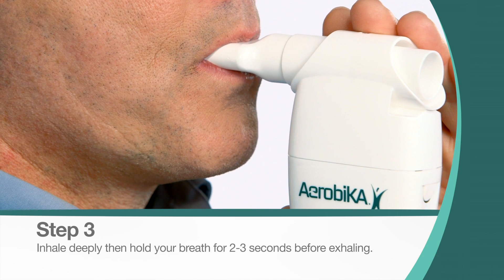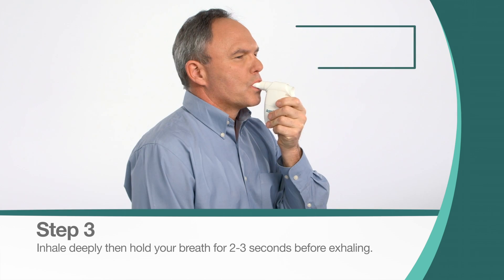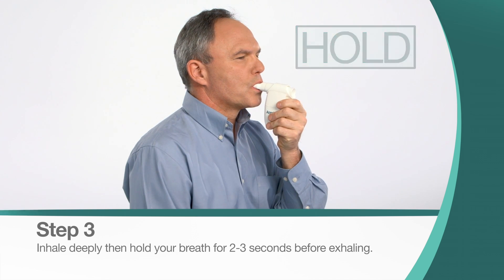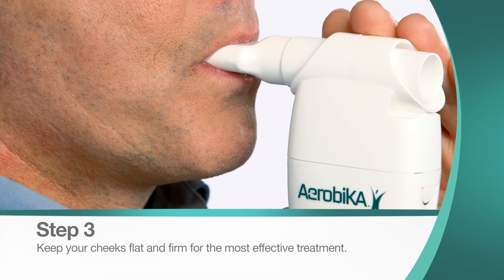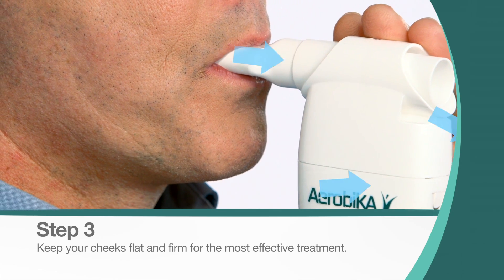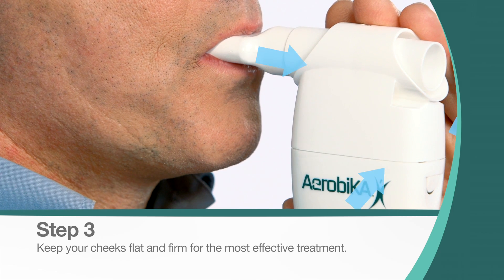With your lips still sealed around the mouthpiece, inhale deeply. Then hold your breath for two to three seconds before exhaling actively, but not forcefully, through the device. Active exhalation should last three to four times longer than inhalation. Keep your cheeks flat and firm for the most effective treatment.